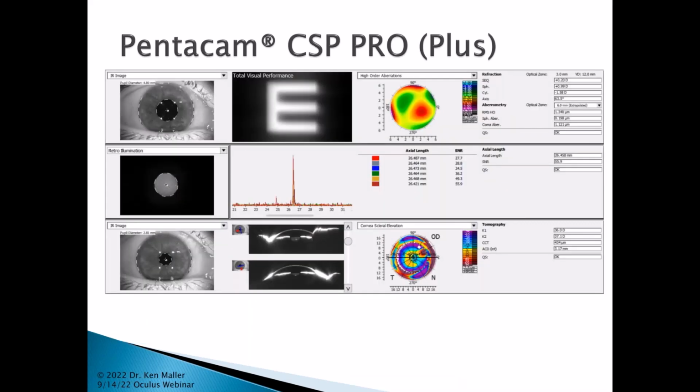This here is the overview screen that comes along with the CSP Pro software. And again, I put in plus because it's not just about the CSP data. We take a look over here, and the first panel in the upper third is really about aberrometry, so that's all the information that was gathered on the aberrometer being displayed in that upper panel.